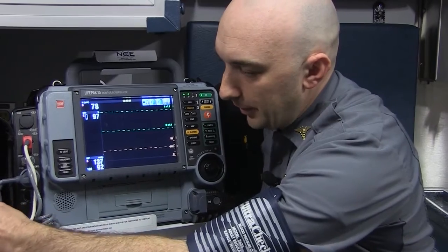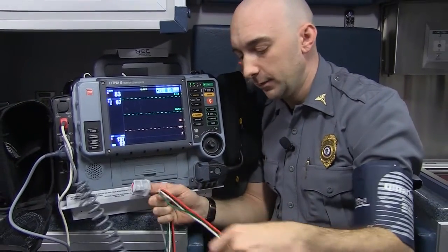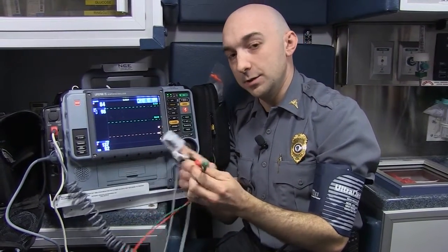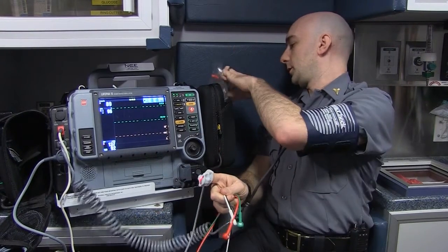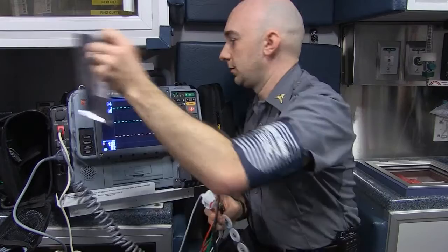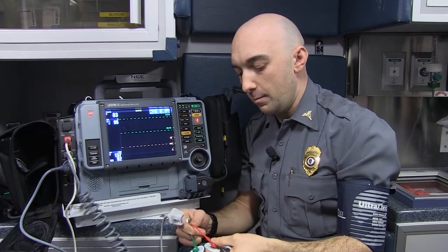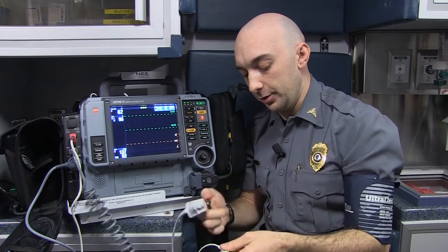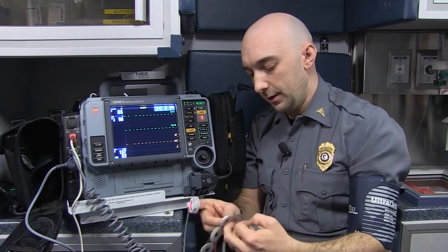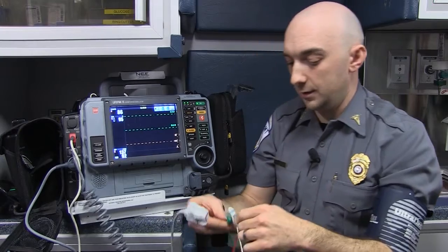Once we start getting into cardiac monitoring — if anybody's ever been to the doctor and had an EKG or a stress test — they'll be familiar with these electrodes. They measure the electricity flowing through your heart. A lot of things in our bodies — all of our muscles and nerves — are controlled through very small amounts of electricity, and this device is designed to pick up what's going through our heart. I'm going to put some on my legs here.